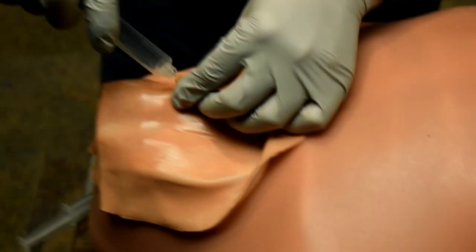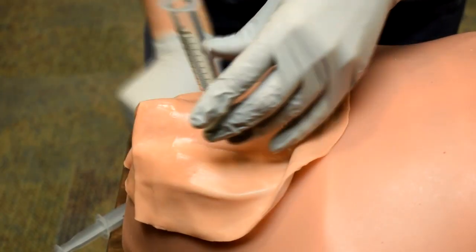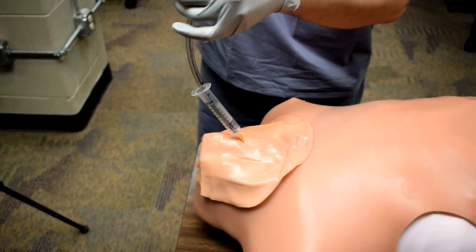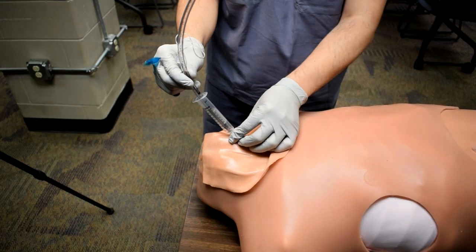Take the plunger out of the syringe. Attach the syringe to the angiocath. ET tube into the syringe. Inflate the cuff. And then I can attach my endotracheal tube to a BVM.